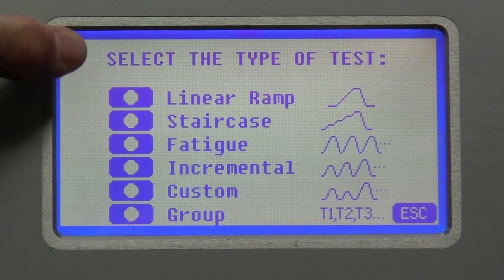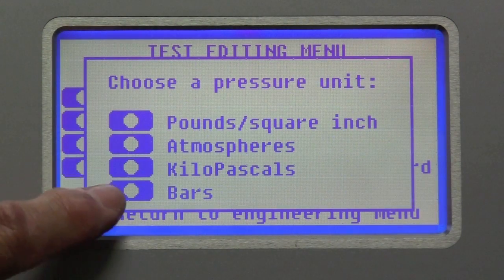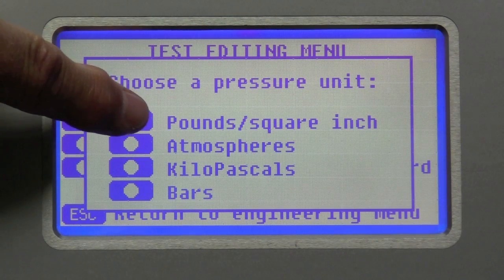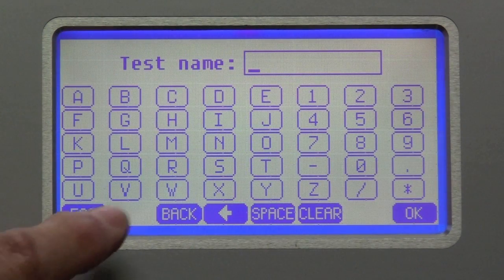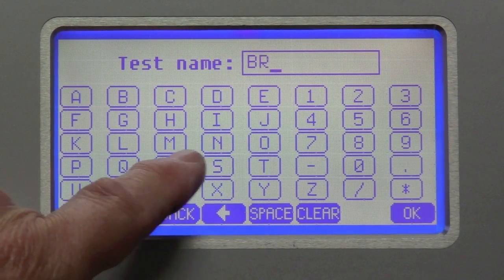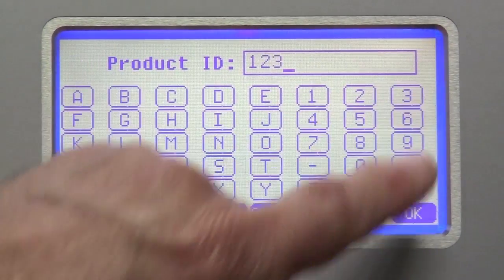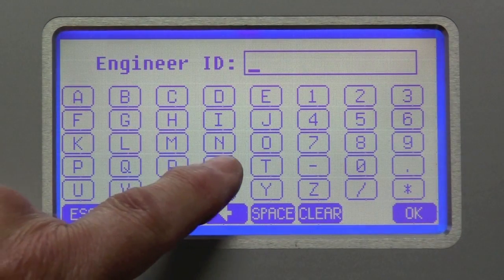We're going to do a burst test, so we're going to use a linear ramp. Here we choose the engineering unit. In this case, I'm going to choose pounds per square inch. And I'm going to call the test a burst test. And I'm just going to abbreviate it. Product ID, I'm going to call 123. Engineer is me.